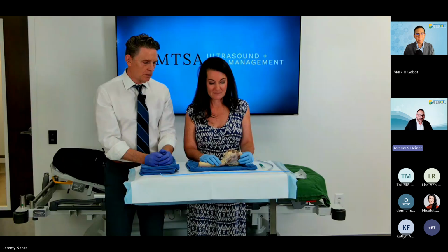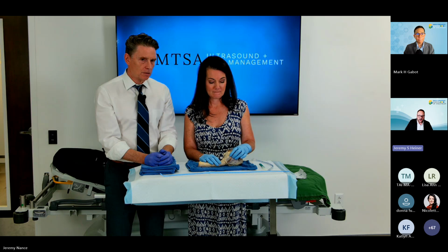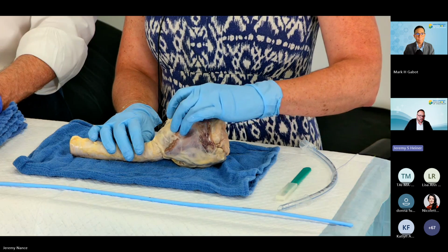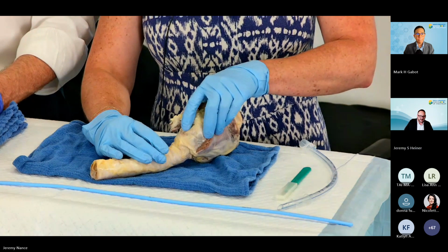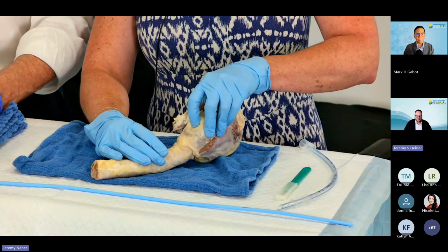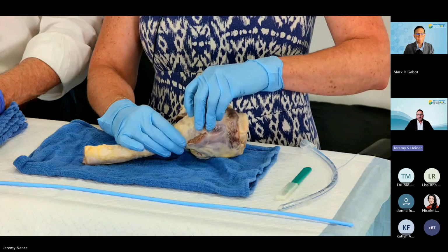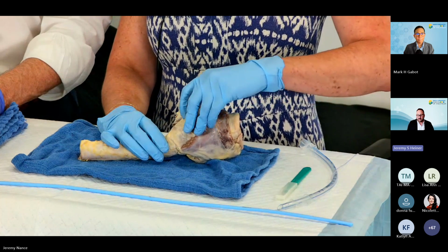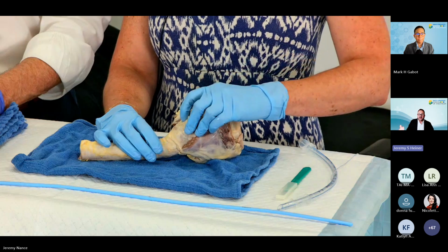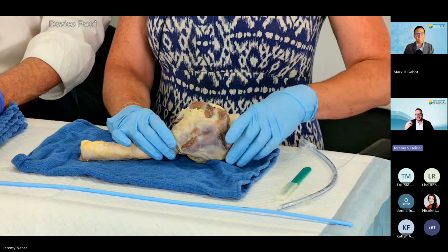That way she can use her non-dominant hand to lock in that larynx and lock in that thyroid cartilage. So there you can see that she has her thumb and her middle finger on that thyroid cartilage, and she can use her index finger to palpate the cricothyroid membrane. So we can see that perfect. Excellent. All right, so she's filling that indentation. Now, again, if we've done POCUS and we have already marked, that's going to help us identify where it's at. If not, and this is an emergency situation, maybe the patient has a lot of neck tissue.